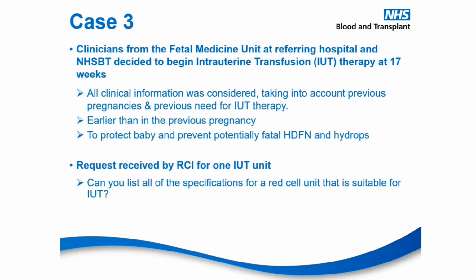So all clinical information was considered, taking into account the previous pregnancies, earlier than previous pregnancies. These decisions were all made to protect the baby and prevent this potentially fatal HDFN and hydrops occurring.